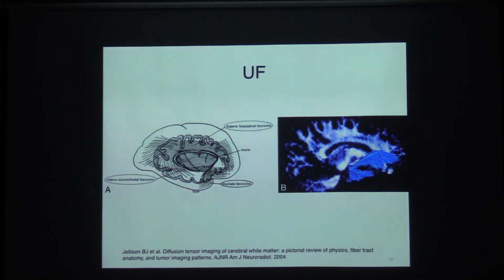So again, next time you see brain tumor, high-grade glioma, infiltrating gliomas, check where it is, and then check your white matter anatomy, and then try to find things along that tract, because I guarantee you that you're going to start finding things that are farther out that people have not noticed.